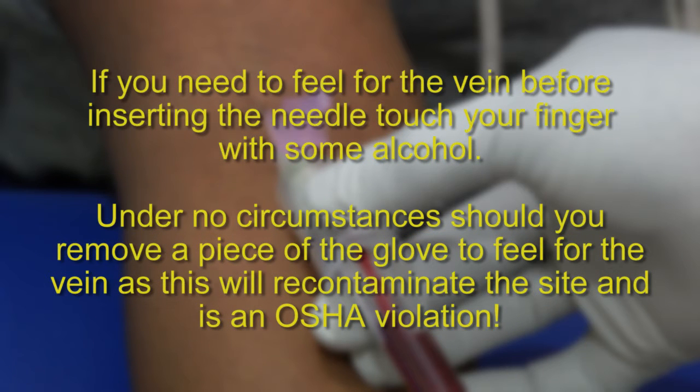If you feel you need to feel for the vein prior to inserting the needle, touch the finger with some alcohol, and under no circumstances should you remove a piece of the glove to feel for the vein. This not only will recontaminate the site, it is also an OSHA violation.